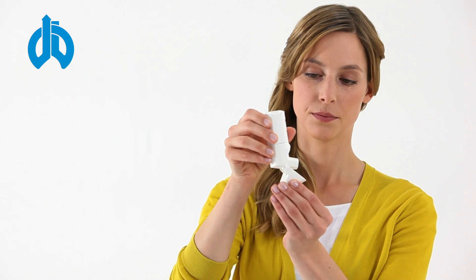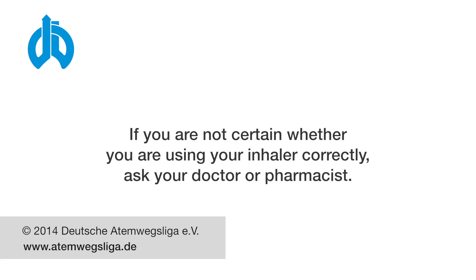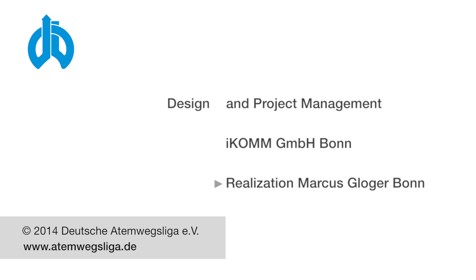Please replace the cap on the mouthpiece at the end of the inhalation. If you need to inhale corticosteroids, please rinse your mouth after use and eat something to prevent oral yeast infections.